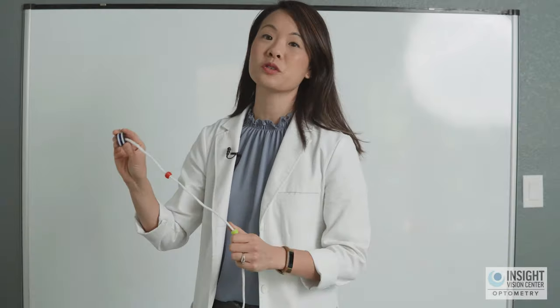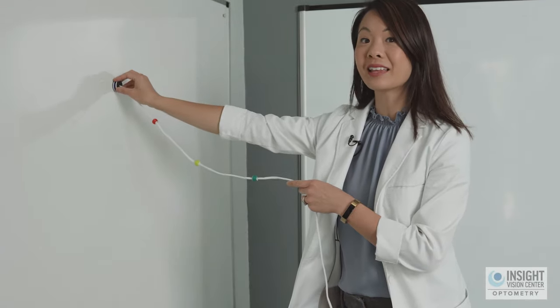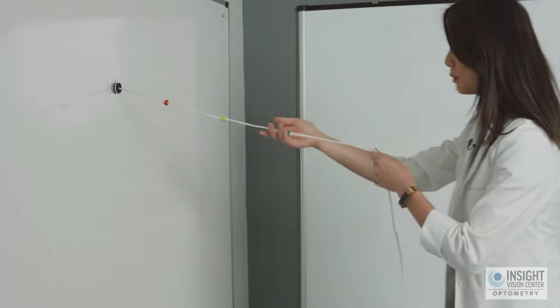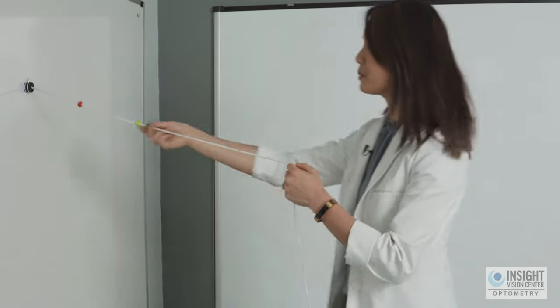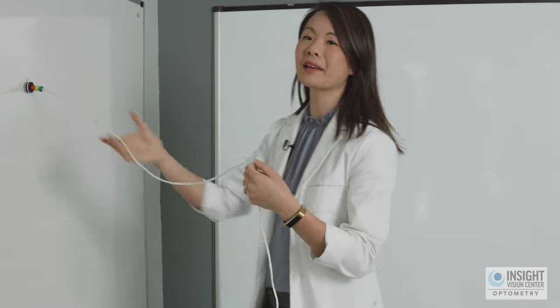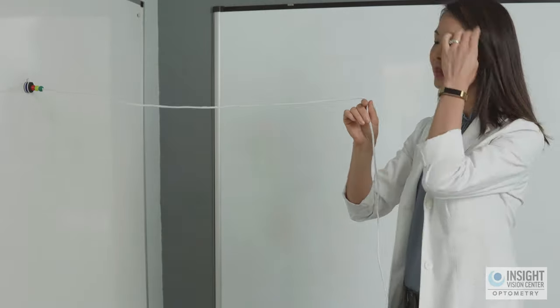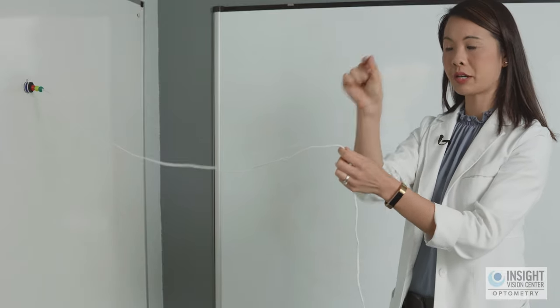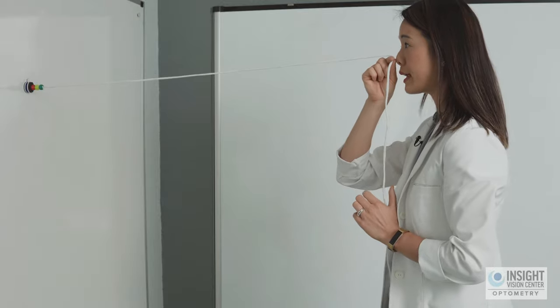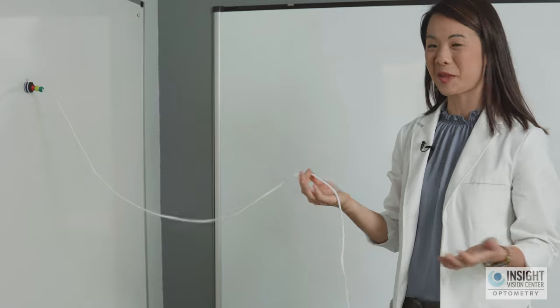To set up this exercise, get a flat surface — I'm using a whiteboard — and put the magnet at eye level. For level one, put all the beads together at the back. I'm standing about two feet away from the board, pinching the tip of the string between my two fingers and putting it right on the tip of my nose. This is the proper way to set up the Brock string.